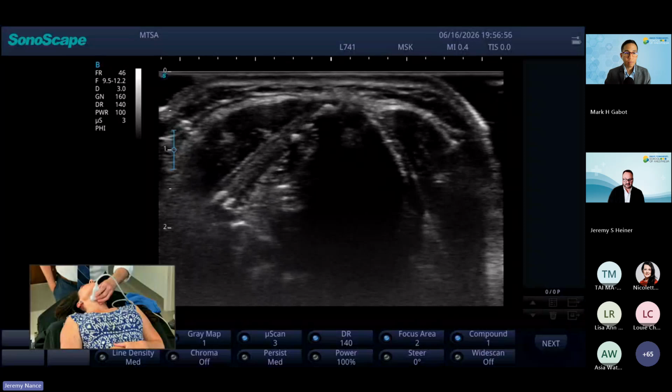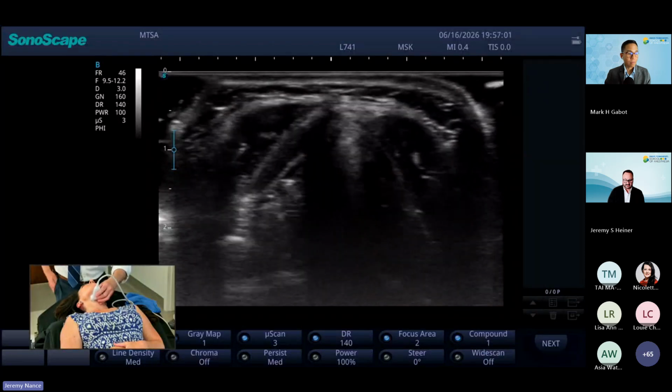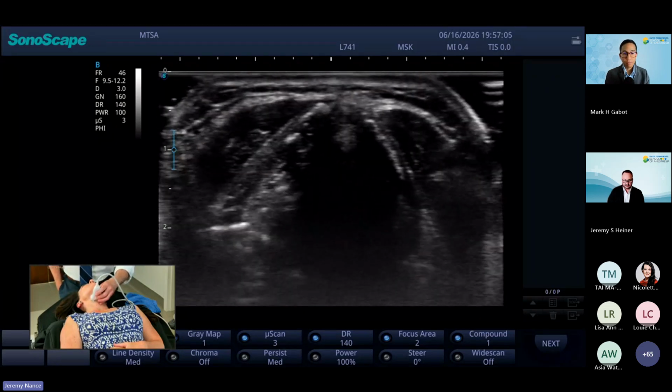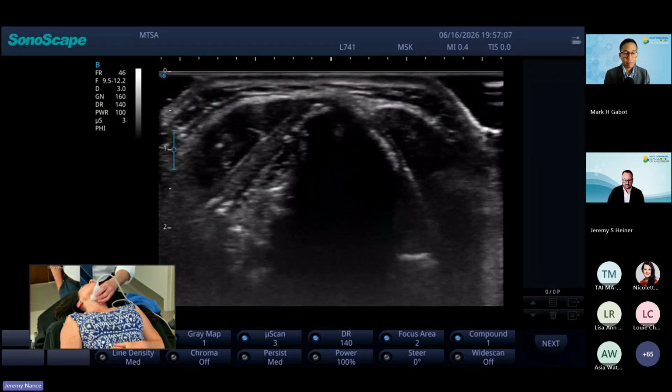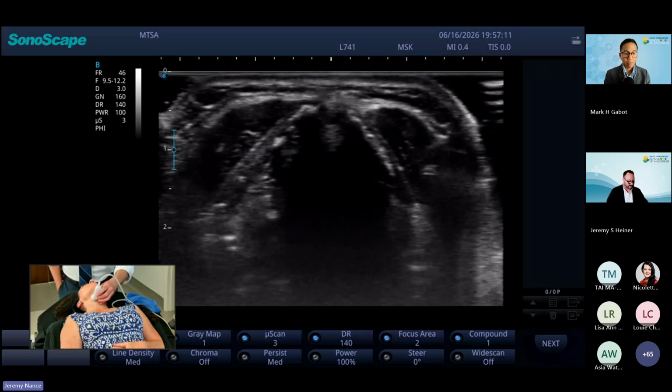Dr. Hoag is young enough that you can see her vocal cords moving, which is great. As we age, that thyroid cartilage tends to calcify and becomes a little more readily apparent. So again, in this TACA method, we're in transverse orientation. The T stands for thyroid cartilage.